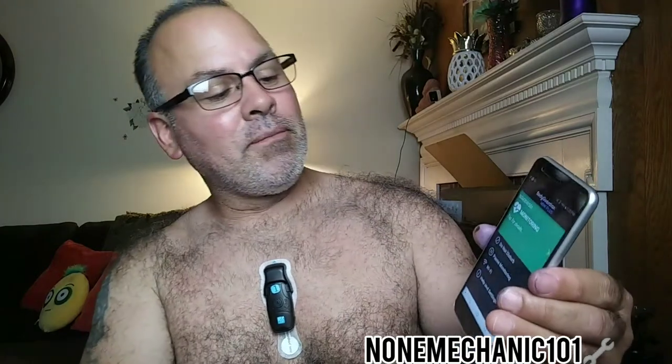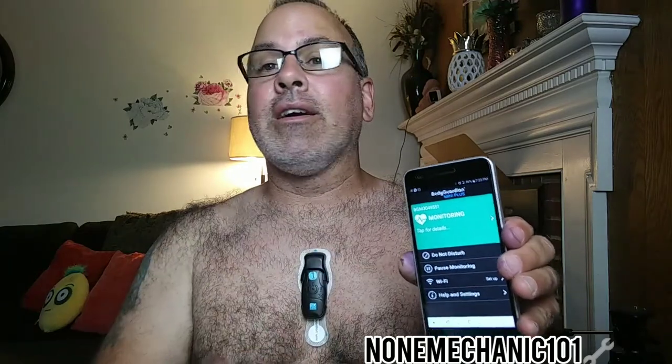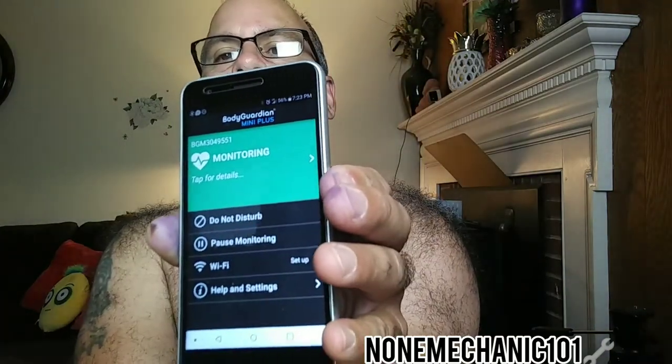Over here it says 'Do Not Disturb' — somebody with a crazy mind might turn that on. Listen, disturb me if something is going on with my heart! If I'm going to die, call me — I don't care what time it is, just call me. And it says 'Pause Monitor' — I do not want to pause the monitor. I want the doctor to know everything that's going on with me. It also has Wi-Fi, a help section, and settings. It's just a regular-looking phone.